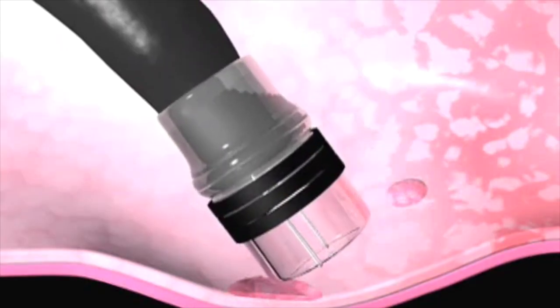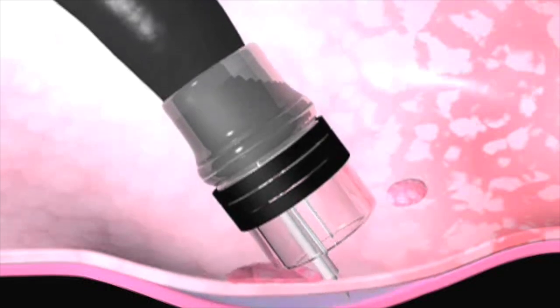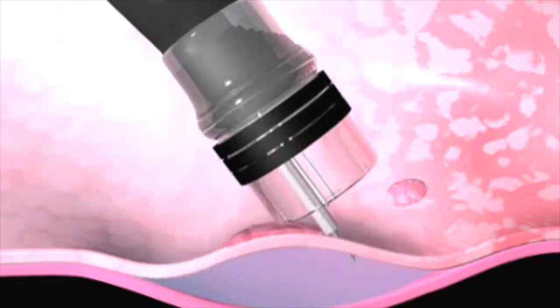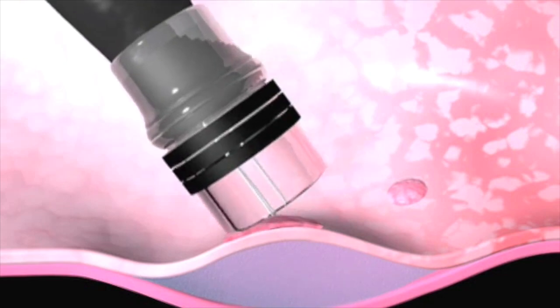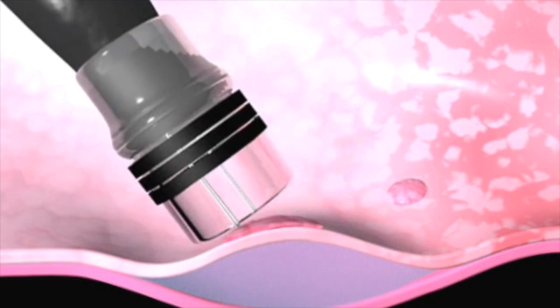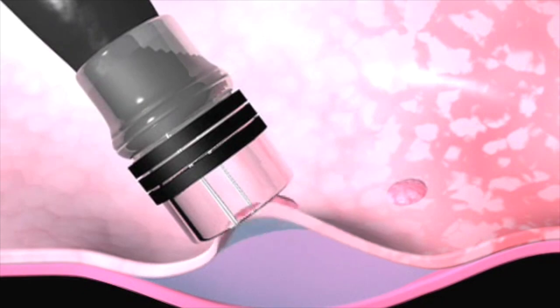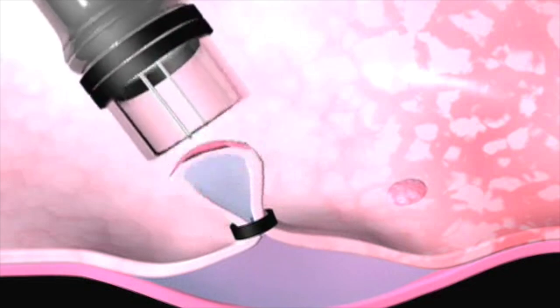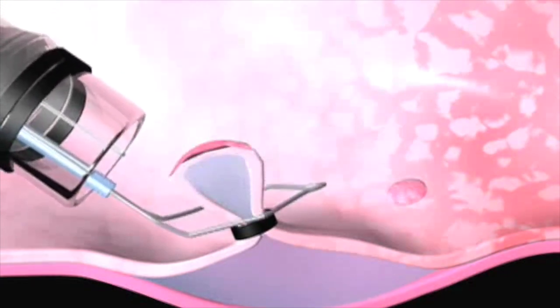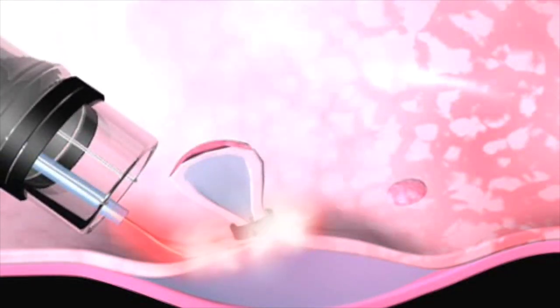When we can see this dysplasia with advanced imaging technologies, we can now remove these areas of high-grade dysplasia using a technique called endoscopic mucosal resection. The abnormal areas are suctioned into a cap on the end of the scope, an elastic band is deployed at the base, and then this tissue is removed with a wire loop snare.